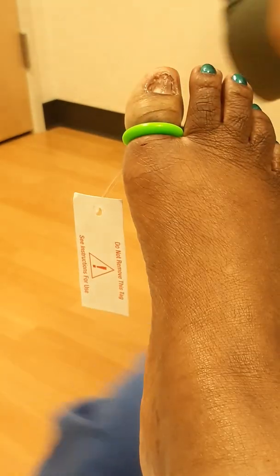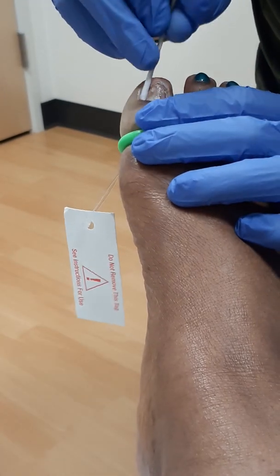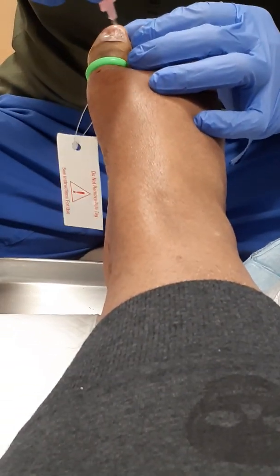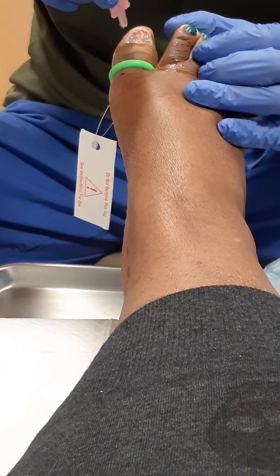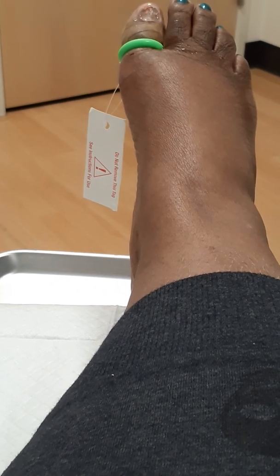All right. I've adequately killed that nail now. It looks dead. Zombie toenail. Maybe move your foot over here for me just a little bit. There we go. I'm just gonna flush this out a little bit. If you don't have that little toe thing on there, does it bleed a lot? Yeah, it bleeds quite a bit more.